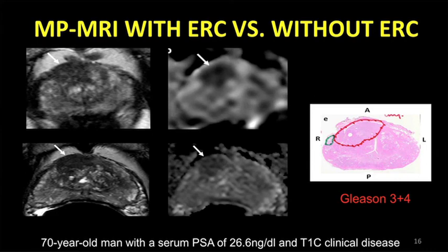And in the meantime, I'm sure all of you are aware of the report of the U.S. Preventive Services Task Force about PSA. They gave PSA a grade D for helping patients with prostate cancer. So PSA is not helping at all, it is not a good screening method, and it needs a replacement. A simpler MRI without an endorectal coil can be a possible candidate to replace PSA.